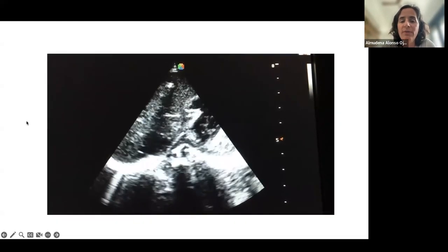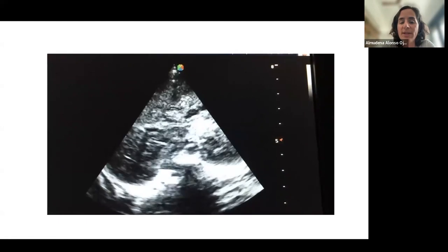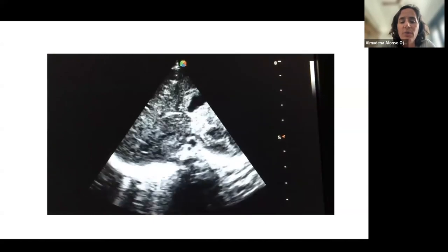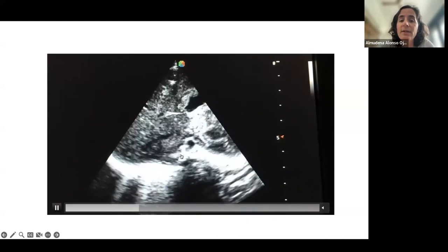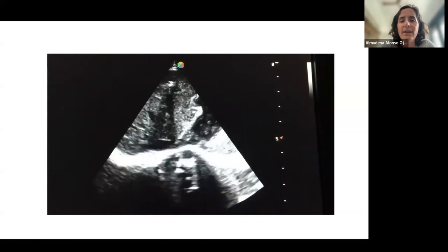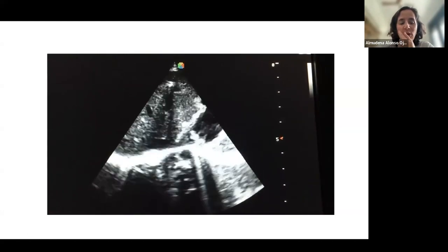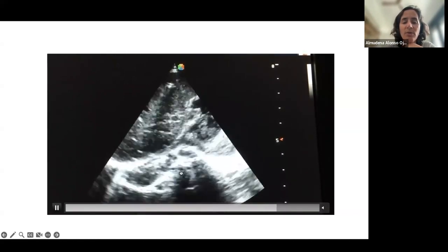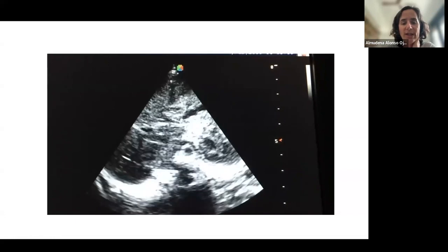And after this, that we've been reviewing about diaphragm excursion, you have to rely on that, as we were saying, the respiratory support that we are giving to a patient is also influencing these measurements. This baby here is a baby who had a severe brain damage, and he was already in brain death, but he was still intubated, waiting for donation. And as you can see here, if we perform just this subcostal approach, we are watching a diaphragm which seems to be moving, although the patient was already dead.